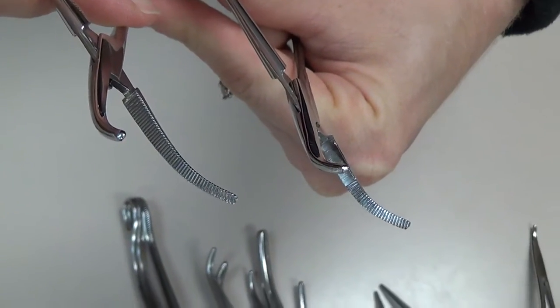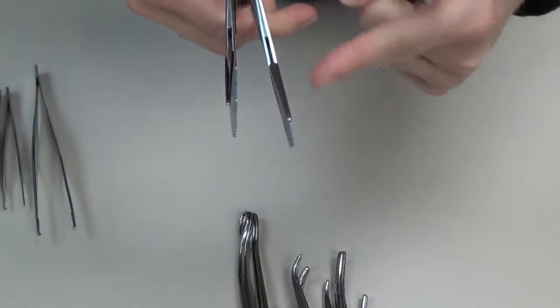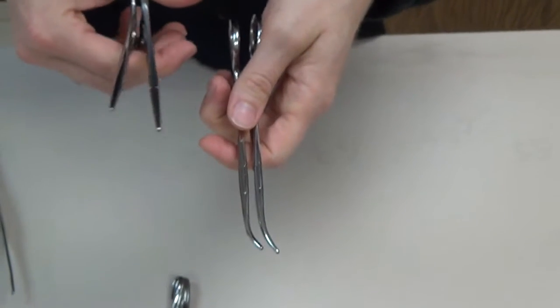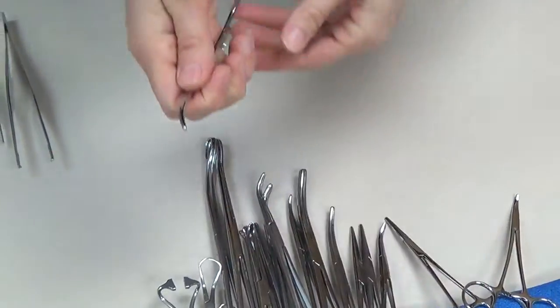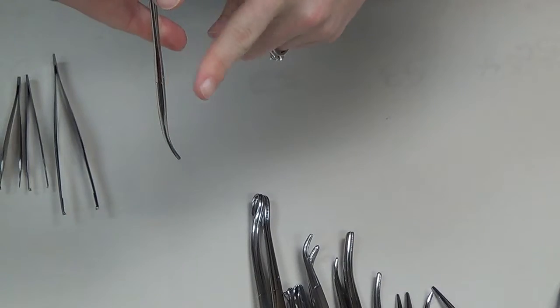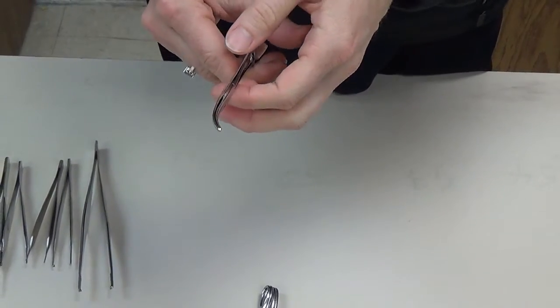Both the Kelly and Crile come curved and straight, and are utilized either to clamp onto a vessel or structure prior to resection, or to clamp off an area that may be bleeding. Most commonly we use the curved version so surgeons can see the tip during blunt dissection. They can also be used for buzzing a hemostat — grasping bleeding tissue and applying a cautery pencil to the side. If a surgeon asks for a hemostat, they're usually asking for a Kelly or a Crile.